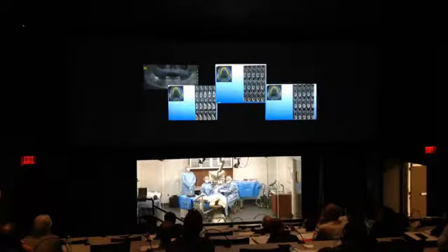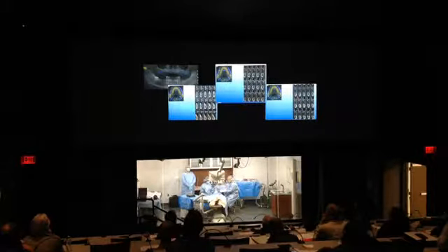She has good vertical dimension there, so the thickness that you see on the slices there, and I'll go over the CT scan on how to read that a little bit later on. Good quality of bone as well, not just the quantity. So these are things that we get from the CT scan.